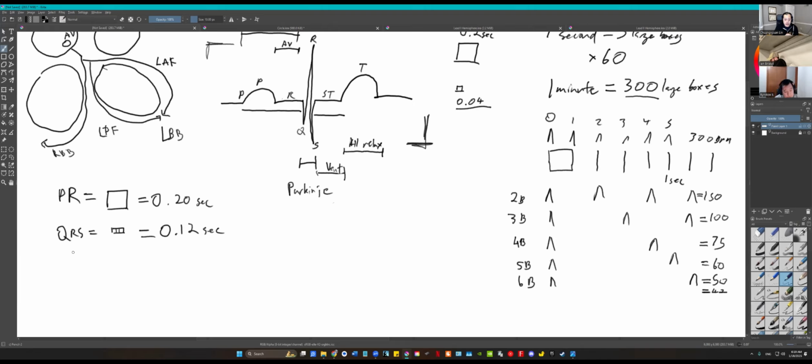And then the QT. This is the QT. The QT should be, yeah, this is rate dependent. Does the QT start at the end of the QRS? The QRS is usually so narrow it doesn't matter. I let the machine handle this one, mostly because there's a correction formula. There's kind of a black box correction formula that I never remember. I let the machine handle it.